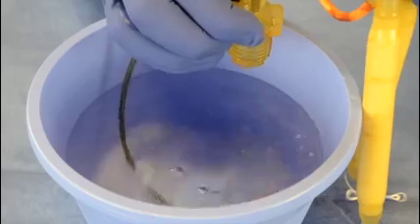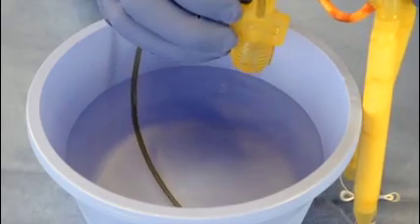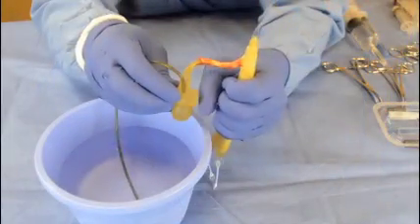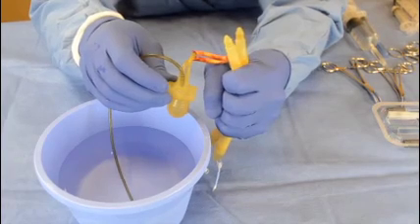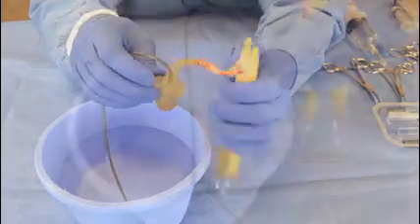Once the cylinders are full, press the deflation button for 2 to 4 seconds to allow air to be expelled from the components. If air bubbles remain in the components, repeat the previous 2 steps until all air is removed from the system. That is, no bubbles are noted in the graduate during deflation. Squeeze the cylinders to remove the remaining saline from the cylinders. Do not squeeze the deflation button and the pump bulb at the same time.